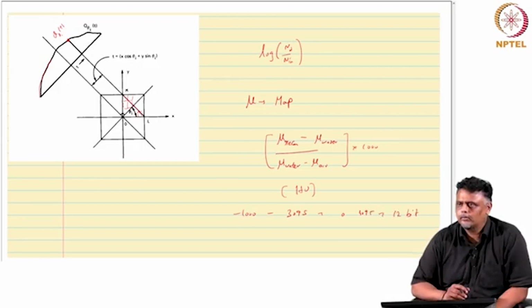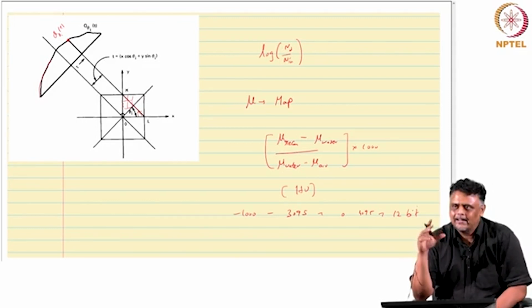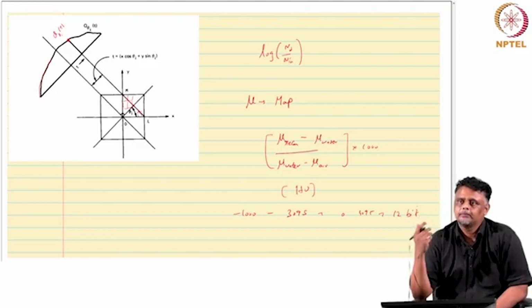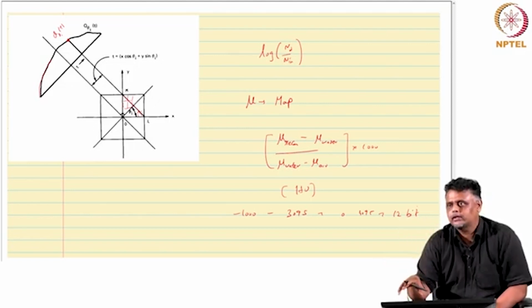So all the outputs from a CT scanner are 12 bits. The reason I spend some time here is that, unlike the other modalities we are going to talk about, MR, ultrasound, and radionuclide imaging, where there is only relative contrast, here the absolute values actually have some meaning.